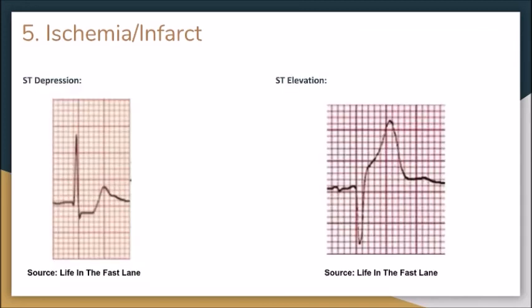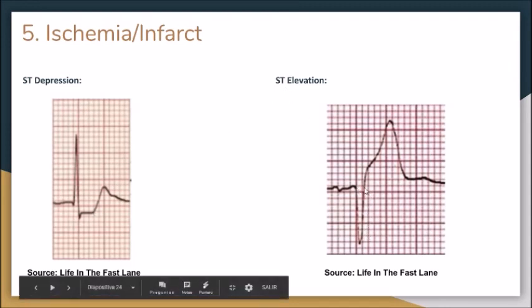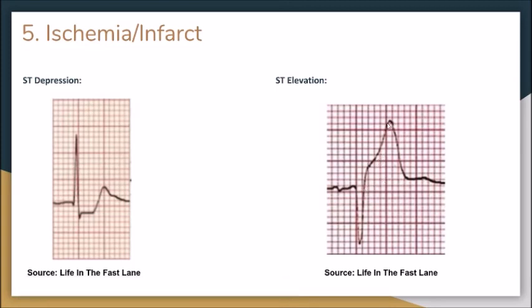So here we have isolated QRS complexes and the things nearby. In this case, we have ST depression. So here's the QRS complex, and this ST segment is depressed compared to the rest of the baseline. You see this is here, that's here, and this is depressed compared to those two. So that's an ST depression. Whereas, if you look at ST elevation, you'll see the QRS here, and the QRS doesn't end here, then go up to the T. Right? The S ends there, and then you go up to the T. So that's an ST elevation. And that's suggestive of a STEMI.